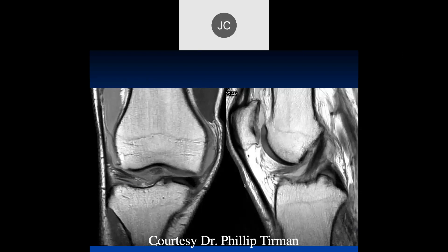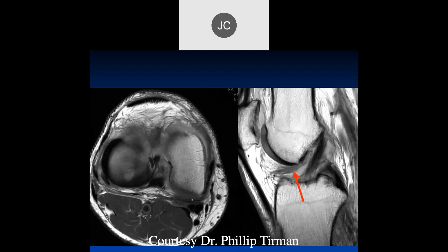For this case with knee pain, on coronal and sagittal images there's a band of fibrous tissue — this is an infrapatellar plica. In this location there are a number of structures with different names that may be the same thing, which can occasionally cause problems but generally just need to be recognized. At surgery, this was fibrous tissue compatible with a plica.